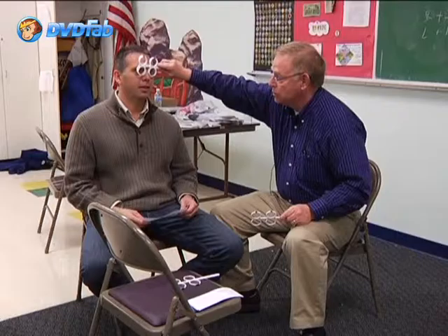All right, so what am I doing while he's sitting down and they're talking and he's verifying the chief complaint that he just made up? What am I doing? I'm getting the lenses, a minus 1.25 and a plus 1.25, and in the other hand, 0.50. Let's pretend his complaint is poor distance vision. So the interpreter tells him, I want you to look at his eyes. I'm going to give you 2 choices. Tell me which is more clear, choice 1 or choice 2. Okay? Choice 1 or choice 2?